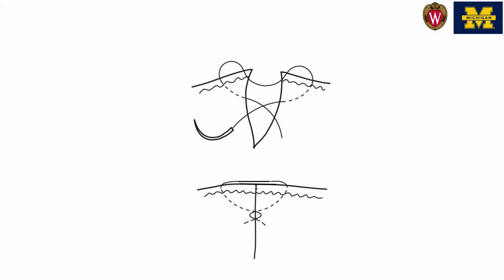So to do this suture, we start in the defect. You'll see where the tail end of that suture is on top. So we go in through the defect on the left, and we come out through normal tissue on the top. Then we loop over the incision, and we come back in through normal tissue and then out the defect. And then we go ahead and tie the knot as is standard.